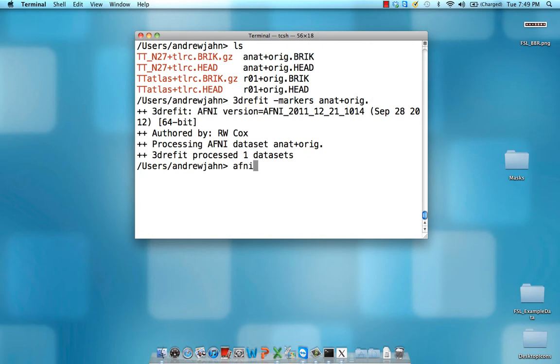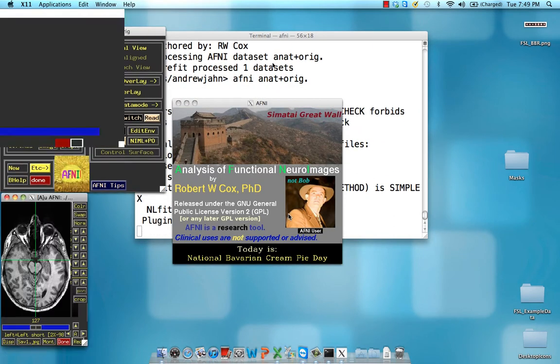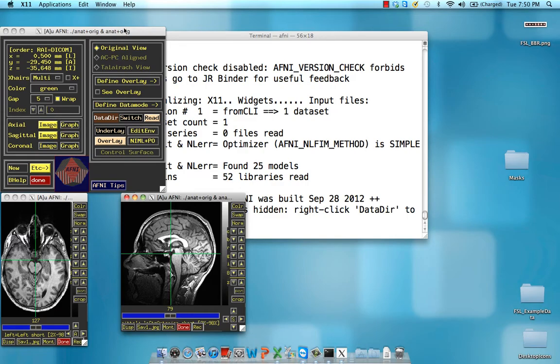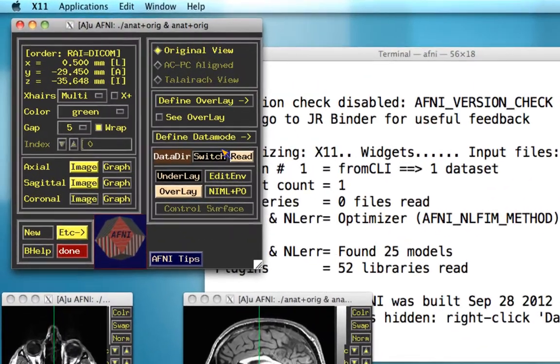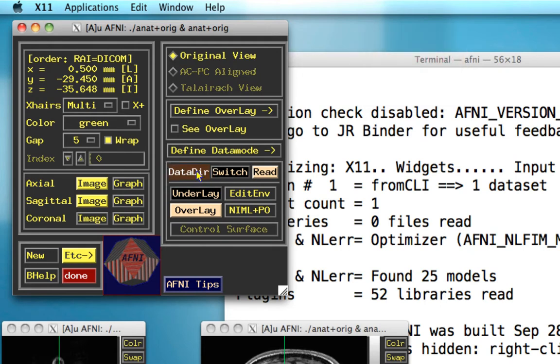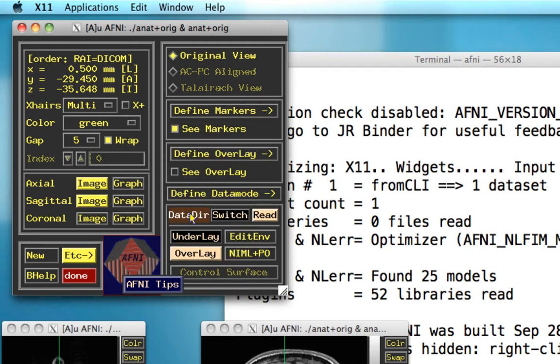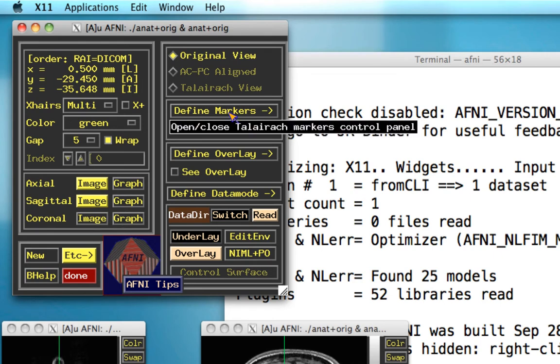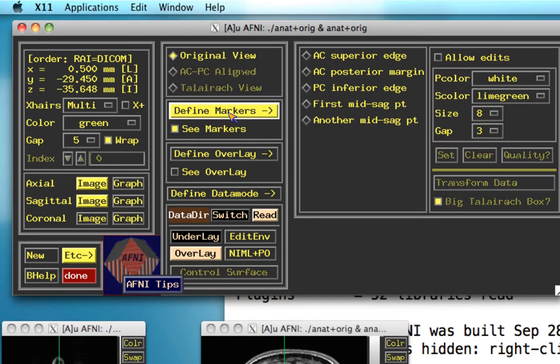Once that's done, open up AFNI and specify the anatomical data set so that it only opens up that data set. If you're using a relatively recent version, something updated in the past couple of years, right-click on the data DIR tab. This will make visible the Define Markers tab, which you'll need to open up. So click on that.